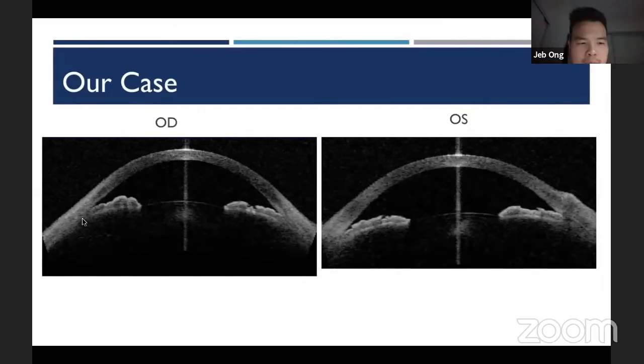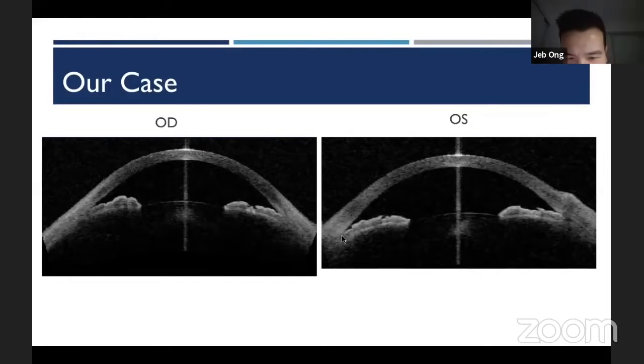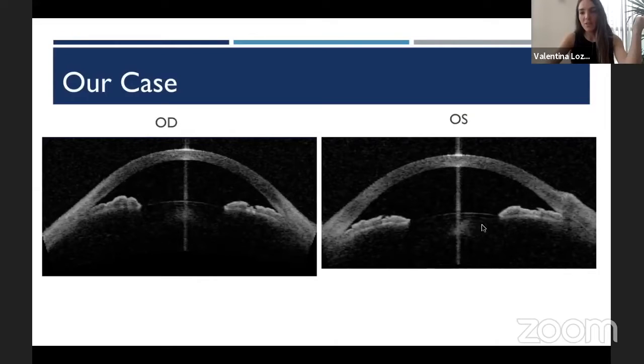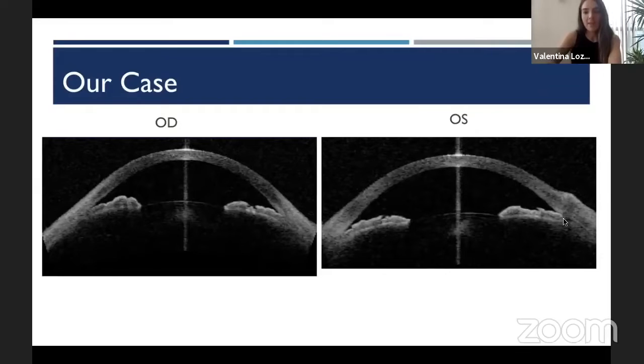Well, anyway, so you want to point out that scleral spur. I mean, it's hard, right? It's not the bread and butter here. And I would say I can actually see it a little bit better on the left. Can you kind of use the ciliary muscle method in that one, I find. Right, exactly. So from here to here, all the way. Yeah, the most I can find right now is the ciliary muscle method. Yep, exactly. So by doing that.